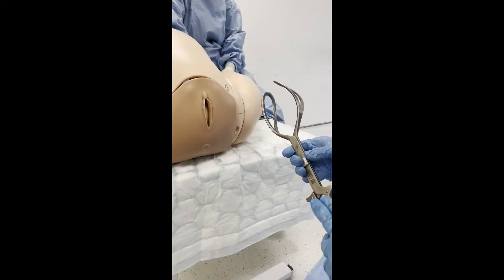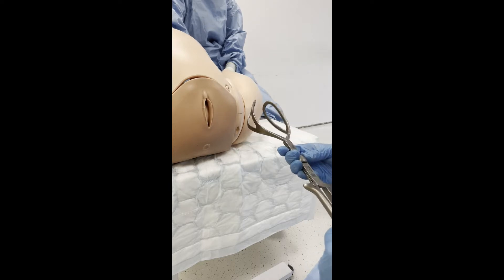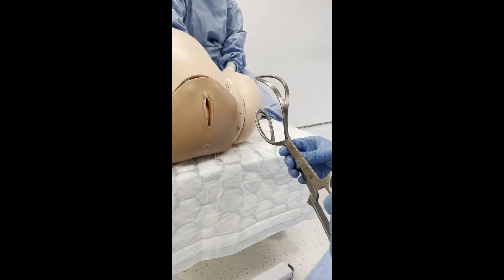The operator brings the forceps to the perineum and lines up the occiput dots to the occiput, in this case on the model's right.